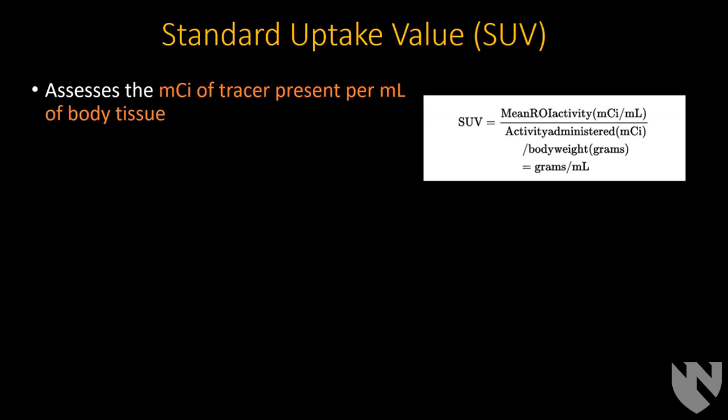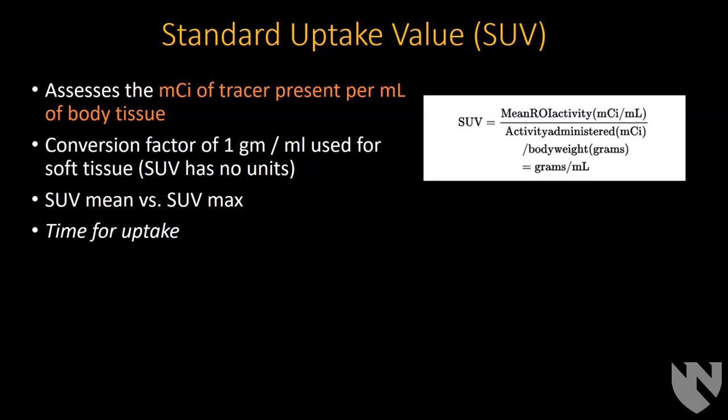But with a patient that has a lot of subQ fat, you're expecting that they've got this large volume that the radiotracer should have been distributed in, but all that fat is not taking it up. So you get artifactually increased SUVs in the normal organs, because you're overcompensating for the size of them when really the fat's not having uptake. So basically that's what all that says.